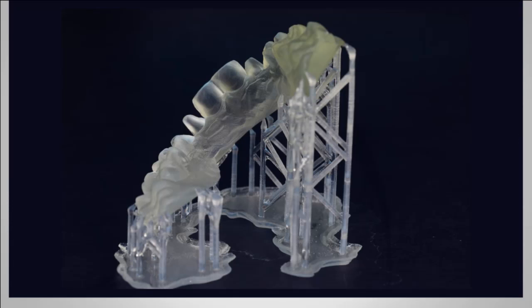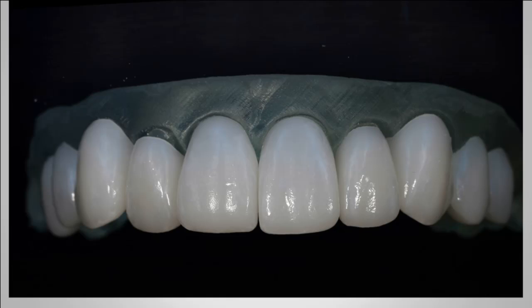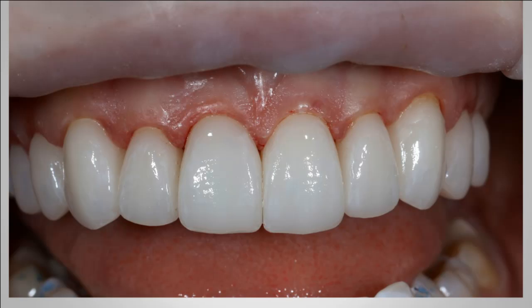Furthermore, today we have the ability to actually print our models. So instead of just virtually designing our teeth, we can also print our models to verify the seat, to verify contours, and also to have an analog model on which we can try our restorations, as you see here. What you see here is a full CAD/CAM reconstruction of the maxilla, and this is the seated restorations the same day as our seat for the 2 implants and the additional teeth that the patient was interested in restoring.